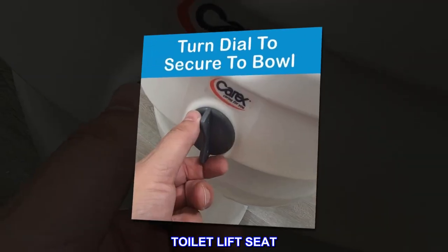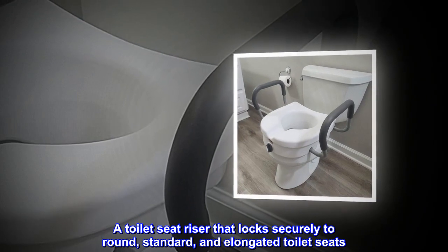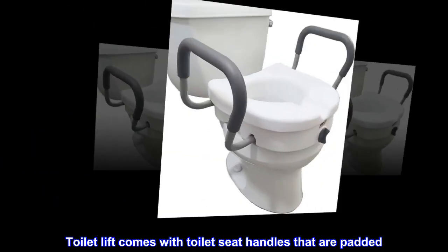Toilet lift seat. A toilet seat riser that locks securely to round, standard, and elongated toilet seats. Toilet lift comes with toilet seat handles that are padded.